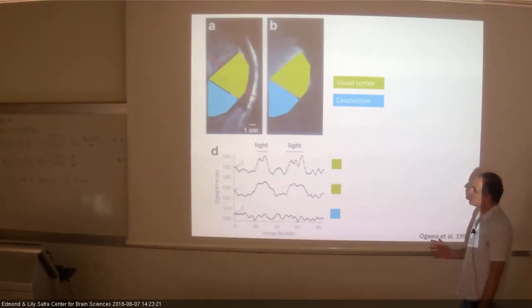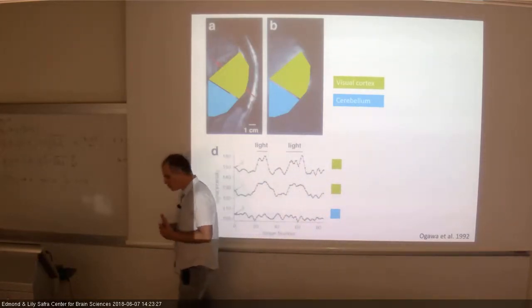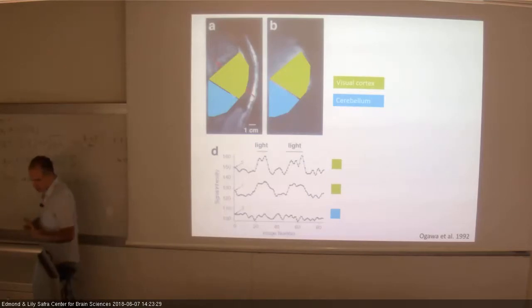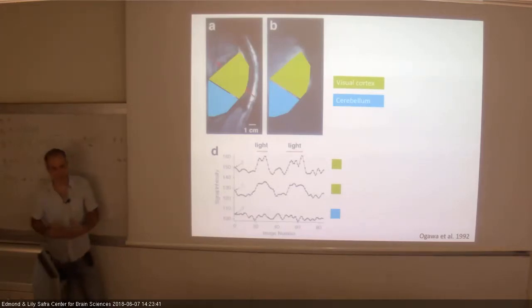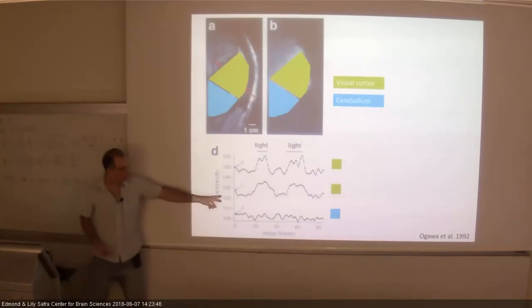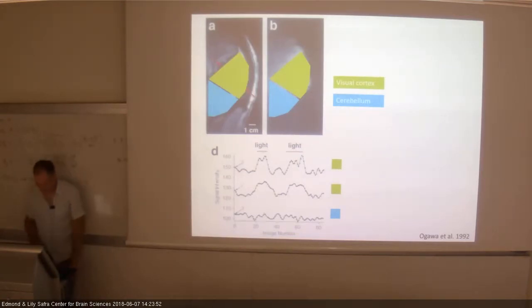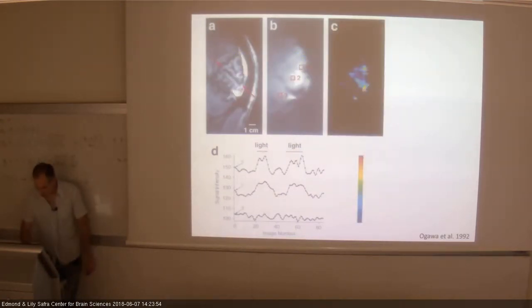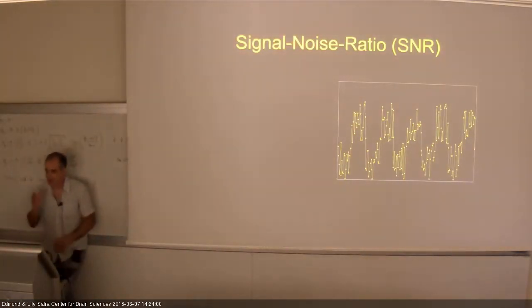So this is the first time they showed it, and again, they took some measures to see that we're really talking about activation here, and they showed that if you show something on the, again, right hemifield, you see this pattern only in the left hemisphere, and so on. Okay, so it was a nice proof of concept that we can present something, shut it down, and we see the bold, the oxygenation level, rises and falls with the presentation of the stimulus. Okay, this is just a statistical map, and this brings me to the first key concept or key idea.